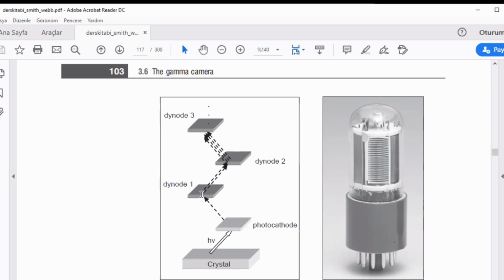They are also attracted to another higher voltage, and they produce more electrons with the hitting, because during the acceleration, like in X-ray tubes, their energy is increased. So from 1, we have 10, maybe 100, maybe 1,000, etc. It's geometrically increasing. The number of electrons here and there are proportional. So this is like an optical or electronic amplifier.